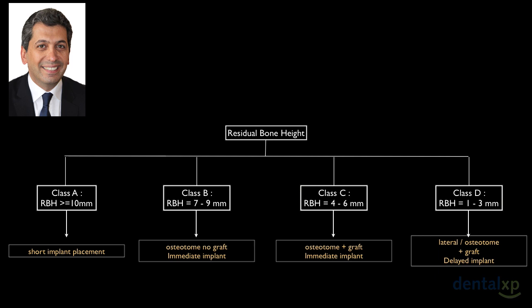It's time consuming. And whenever we had less than 3 millimeters, 1 to 3 millimeters of bone, I showed you in my case series that we could achieve a sinus floor elevation using the internal sinus technique, which is the osteotome. So here it's also a choice of technique, but I usually recommend doing the lateral approach, even though I showed you that the internal approach could be used in basically all cases that we had.